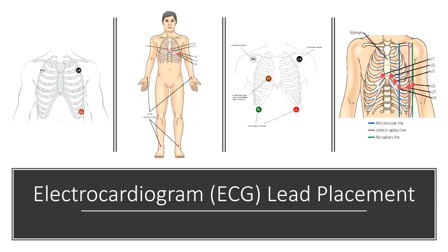It just gives more leads in a 12 lead EKG, and we can have more information about what's happening with the heart. But if your patient's just having surgery or on a telefloor, then they would have the 3 or the 5 leads that are shown in the pictures.